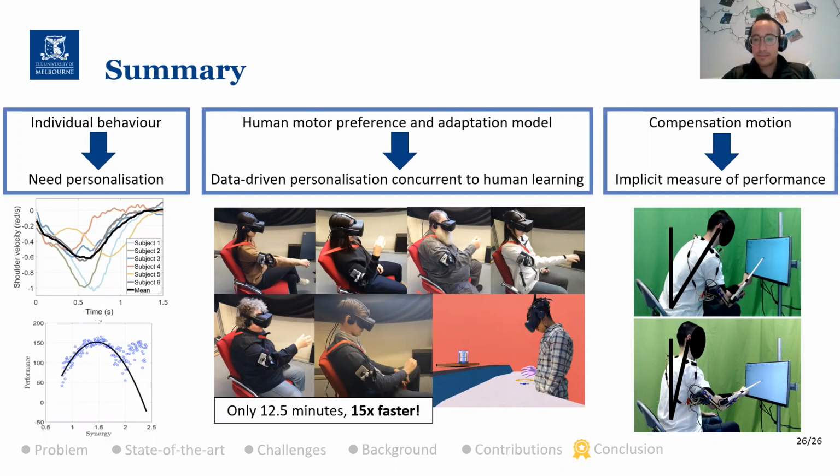Thank you. Just maybe to clarify the synergy parameter, on the current slide, it's around 1.5. Is this a joint angle ratio? Yeah, so in this one it is velocity. It's a linear scaling between the upper arm angular velocity at the shoulder and the elbow velocity. Okay. So from what I could see in these experiments, you're doing repeatedly the same task, and you're doing the extremum seeking over this synergy parameter, right?